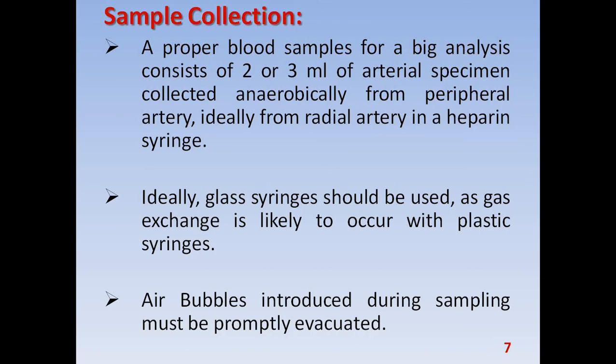You can take that syringe and suck the heparin inside, and then discard the heparin outside. Okay, after that it can be used as a heparinized syringe.